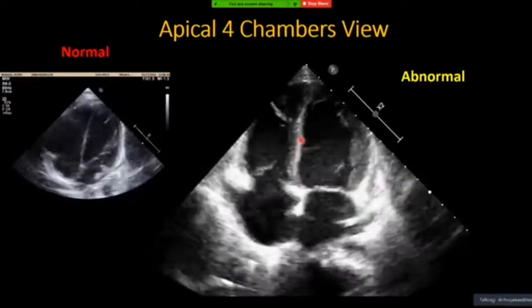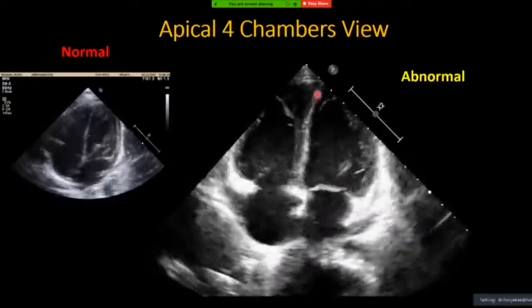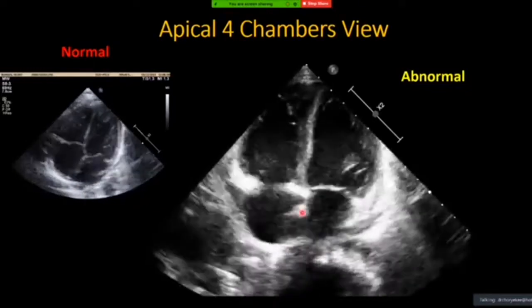Then let's come to the muscle. Okay, so this is a septal wall. The ventricular septal wall looks quite okay. Right, this is the atrial septal. So they're probably missing something there. All right, so you see that maybe there's some defect here.